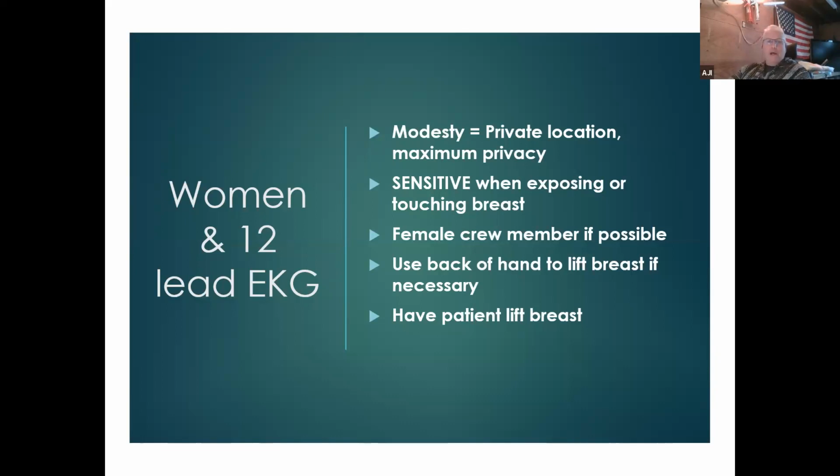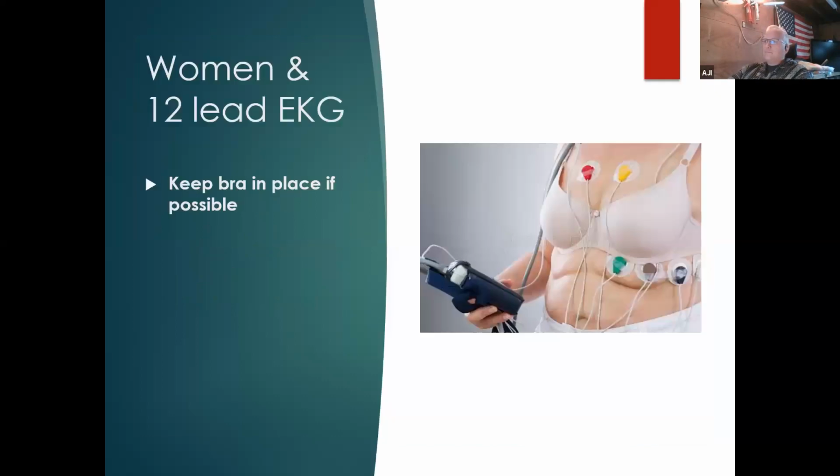That's great, but still do everything in your power to preserve their modesty. Keep a bra in place if you can. I don't necessarily totally agree with that because it might interfere with placement. However, if you can leave it in place, that's good too. It just eases things down the line.